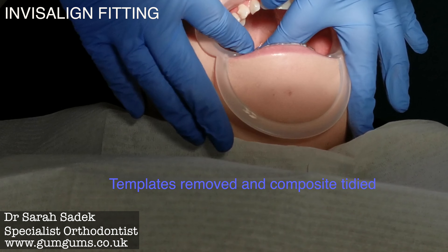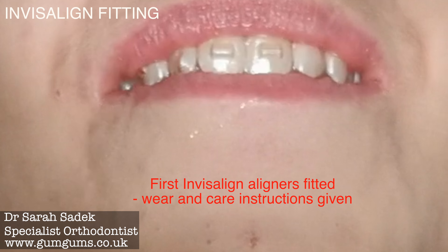Your first Invisalign aligner is fitted and wear and care instructions will be given to you.